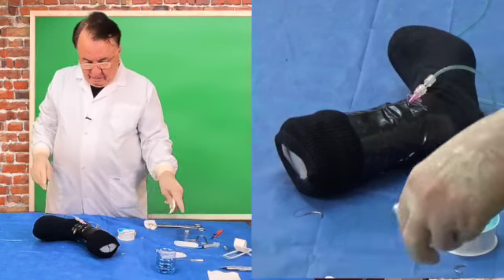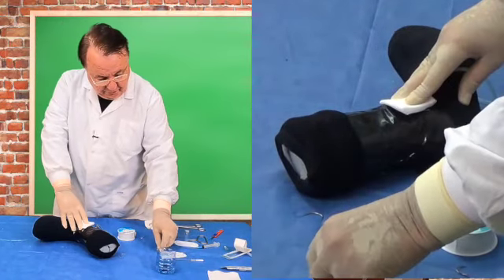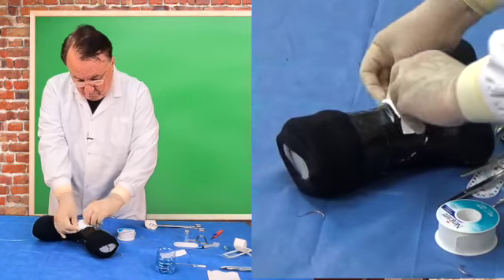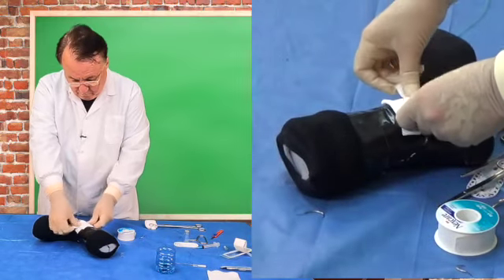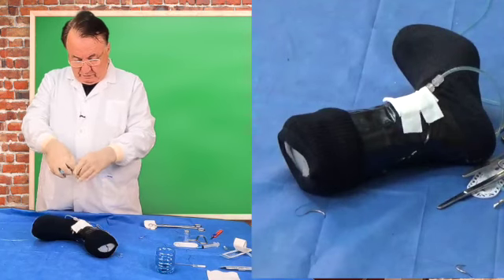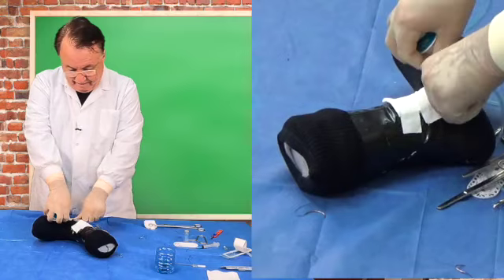We put on a dressing, and we secure that dressing in place. And if you're a little concerned about the catheter itself, you might want to put another piece of tape on it to control it.